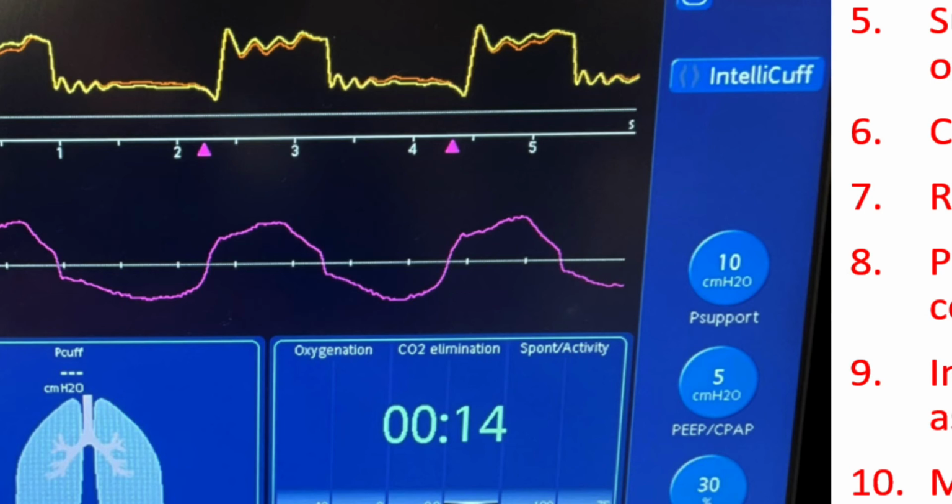So just looking at this, this is somebody who's absolutely appropriate and will probably do well, but I would also anticipate that this is somebody who might need some vent adjustment, whether that's more pressure support, maybe a mode change to pressure control to give them more support that way. Again, you sort of just got to put the valve on and see what happens. They might do fine, you never know. But just walking into it, in my head, I'd be going, okay, this is somebody who I might need to give some extra support to once the valve goes in.